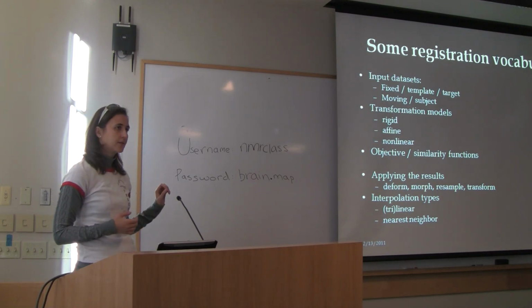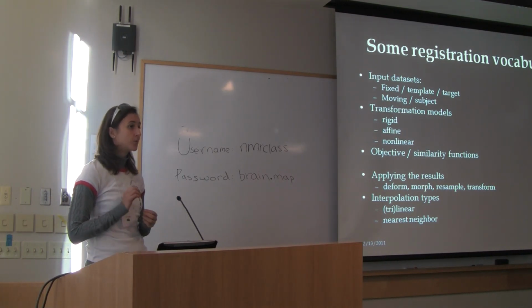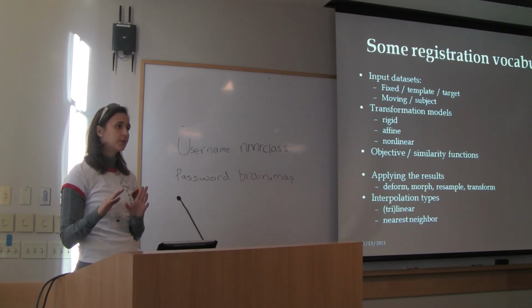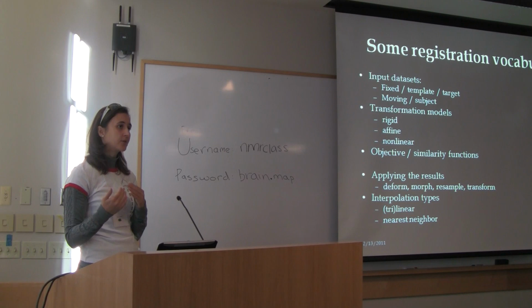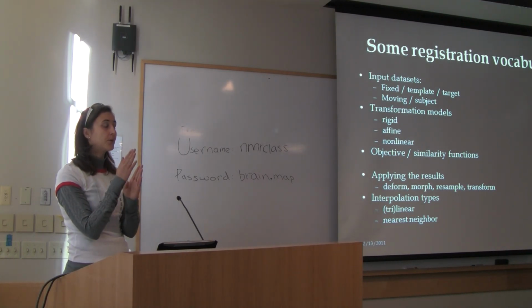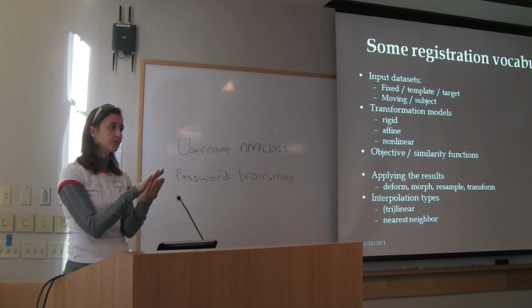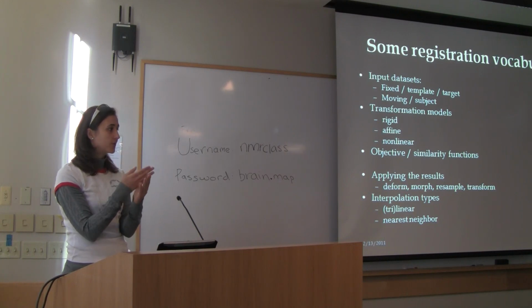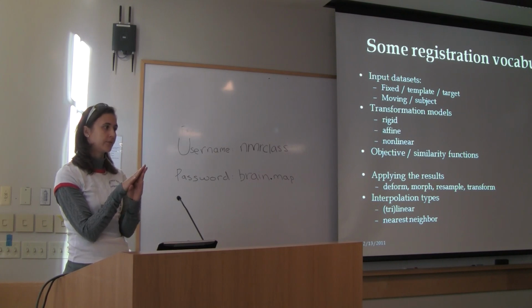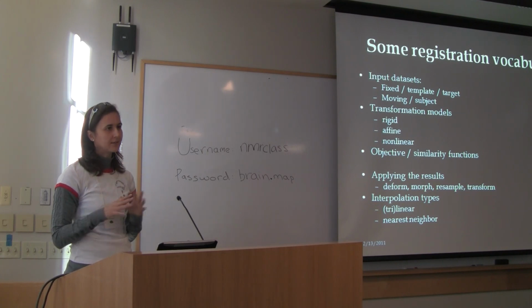When you are using trilinear or linear interpolation, that's a more accurate model to transform your data into the new space. However, it does introduce new labels if your voxel happens to be on the boundary of two different ones. In order to make a smoother transition, it's possibly going to introduce a new intensity value. So this is kind of the basics that you should know.